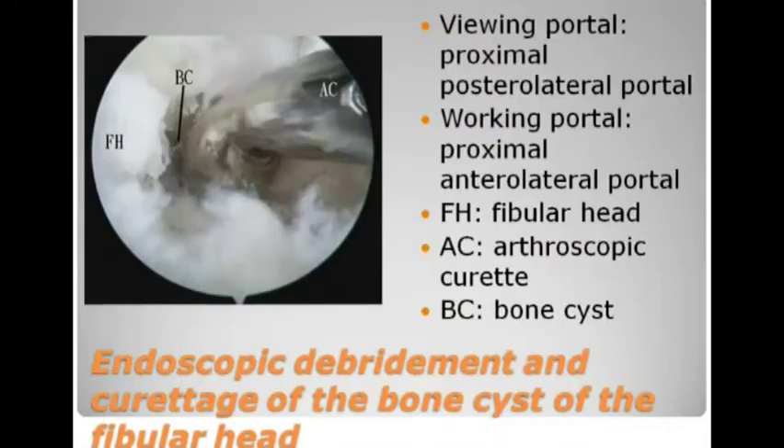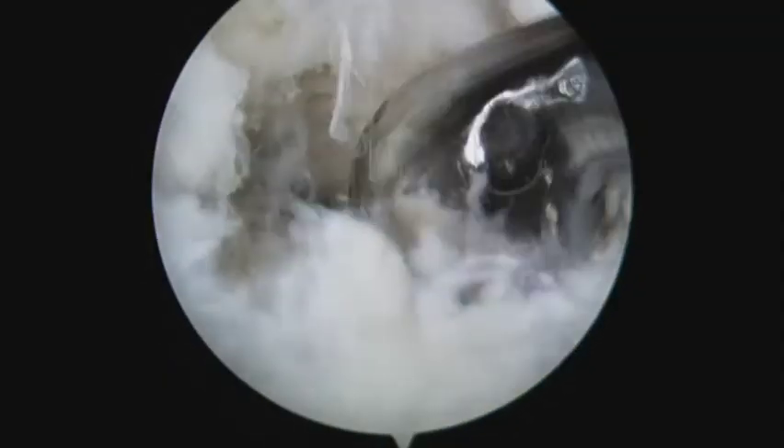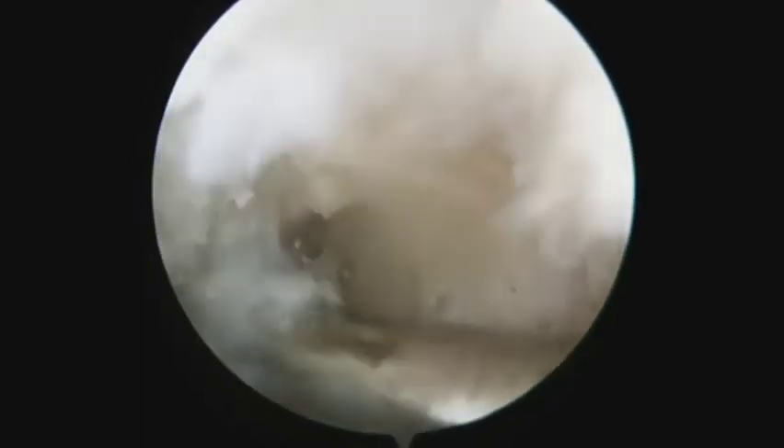After the bone seat is exposed, the lining is curetted by means of an arthroscopic curette and removed by means of an arthroscopic shaver.